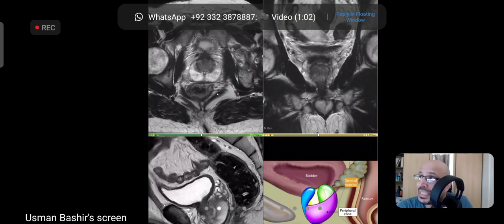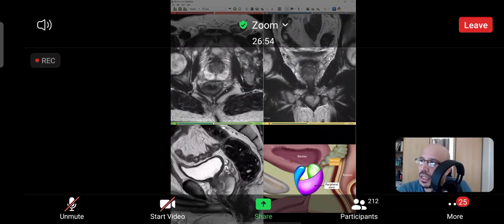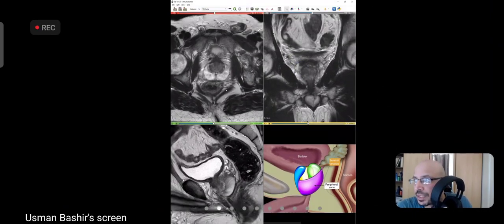Please let me know now if it is too small, and then I'll have to switch to a single view because it's important that you are able to clearly see this. Sarah? So everybody thinks it's just fine.